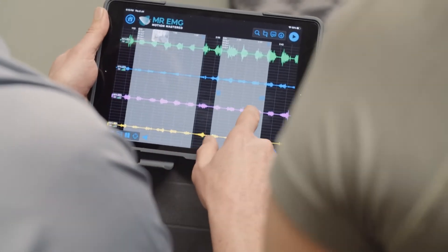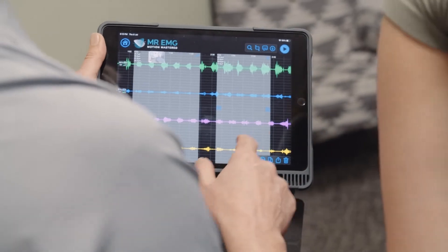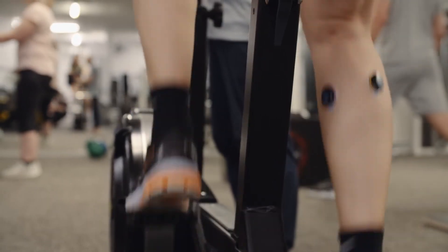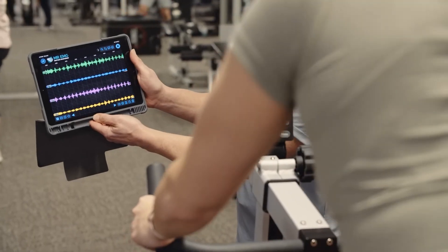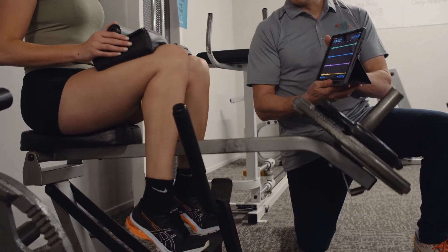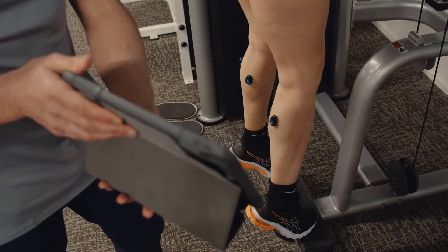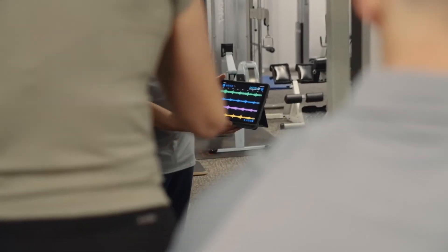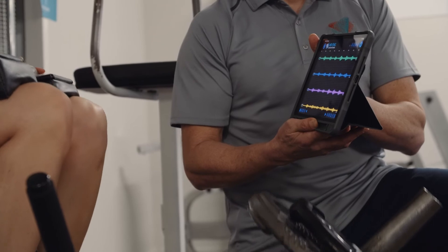Show your subject the resulting EMG data recording of recommended movement changes. Now assess gastrocnemius muscle activity by performing the following exercises. We will start with the stationary cycle, followed by seated calf raises, finishing with standing calf raises. The exercises you test are entirely up to you, the clinician, and what you would deem most appropriate for each subject based on their symptoms.